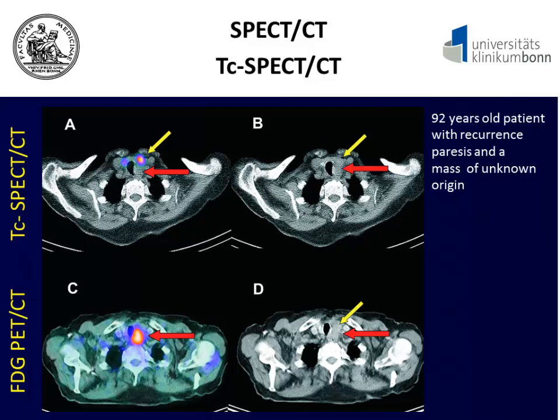And I'm approaching the end of my presentation. You can use SPECT CT for technetium scintigraphy of the thyroid instead of iodine scintigraphy. You know, for patients with enlarged thyroid, especially in the mediastinal region, iodine 123 scintigraphy is better than technetium scintigraphy, but with the SPECT CT, you can use technetium SPECT CT here instead of iodine scintigraphy.